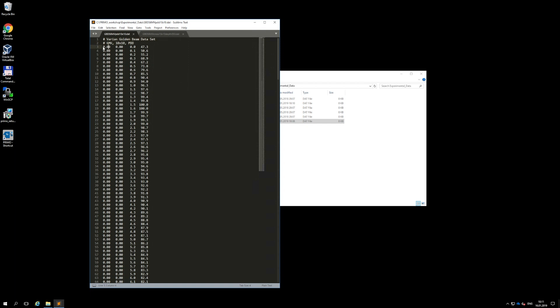Data lines must always contain four entries. The first three entries are the position of the effective point of measurement expressed in centimeters. The order of coordinates is x, y, and z. The fourth entry is the dose in arbitrary units. Notice that the decimal separator is a dot. The four entries are separated by an arbitrary number of blanks, at least one.